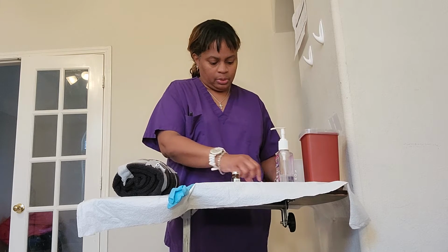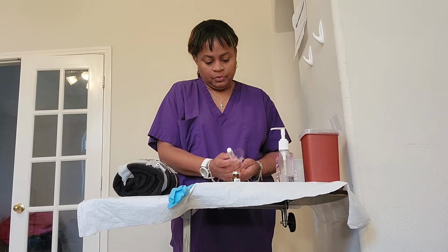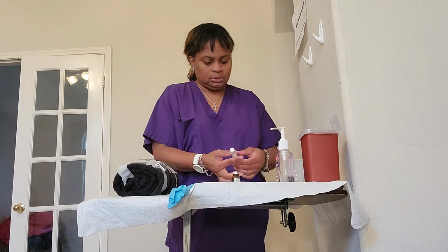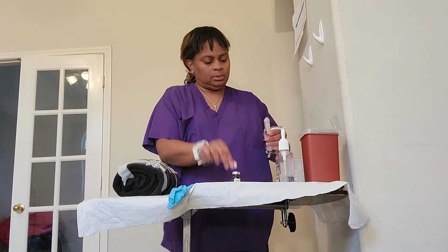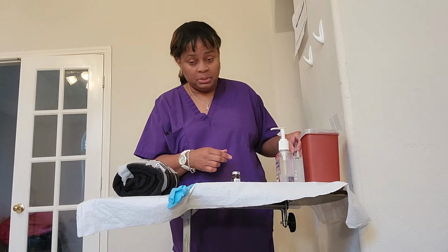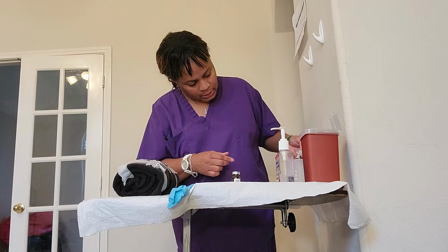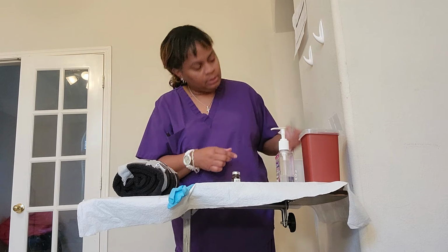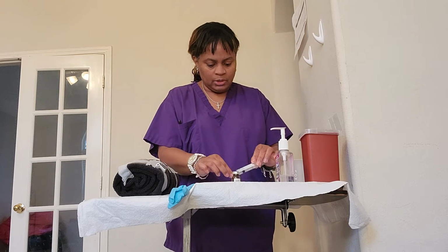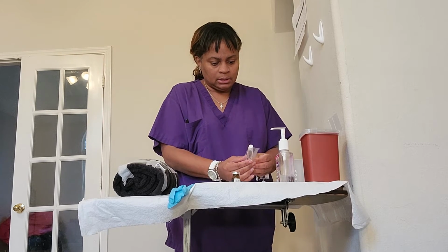And now I will, using aseptic technique, waste my sodium chloride, or my saline. I have 7 mLs that I need to waste because I'm going to be giving 3 mLs before and after the administration of the furosemide. And I have no bubbles in my syringe. I'm recapping it using aseptic technique.